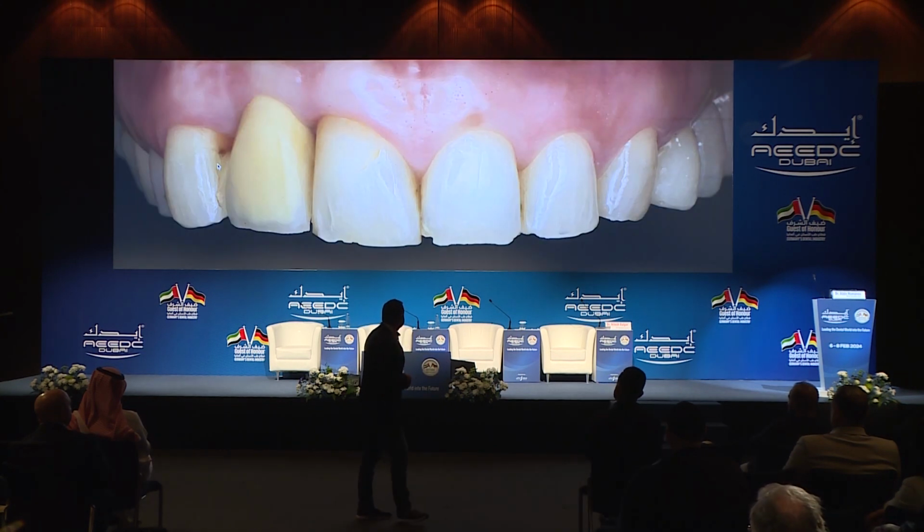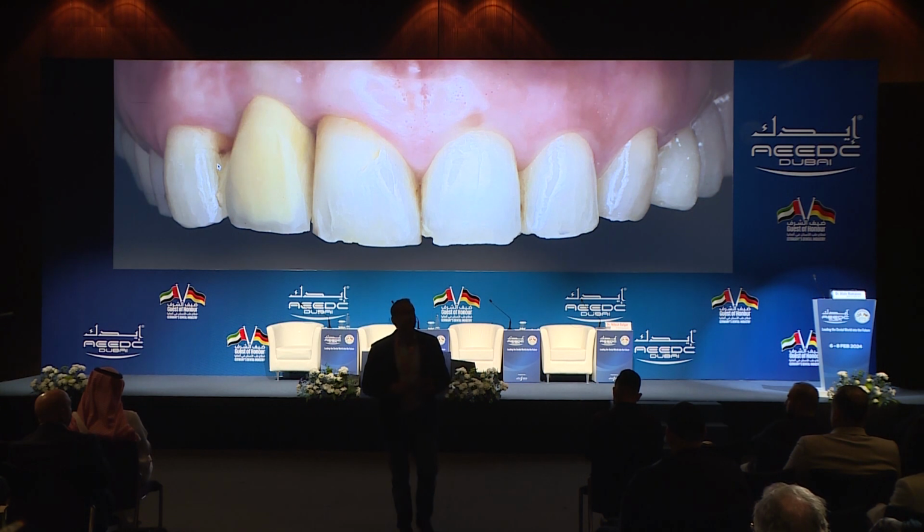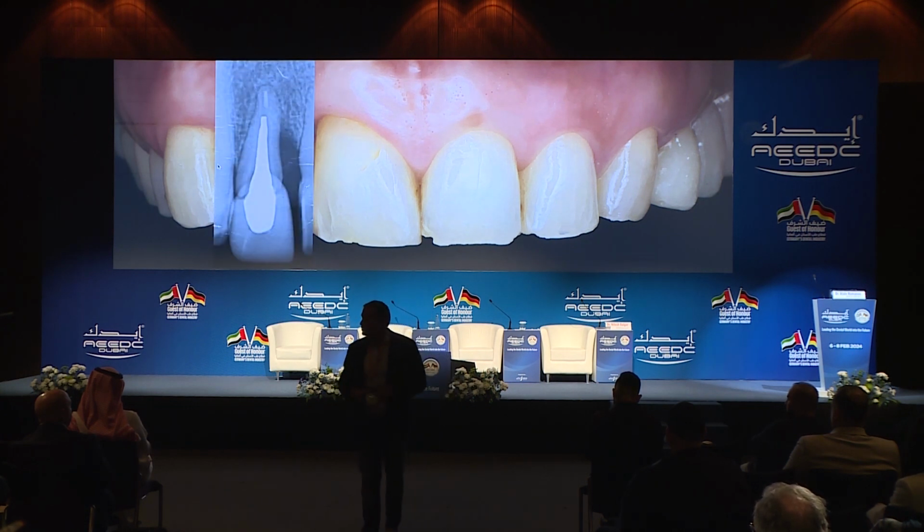Another deep implant placement. This is a recent case, but I learned a lot from it. This patient first came to see me a few years ago to treatment plan this lateral. And this is how she presented, with this failing lateral incisor.